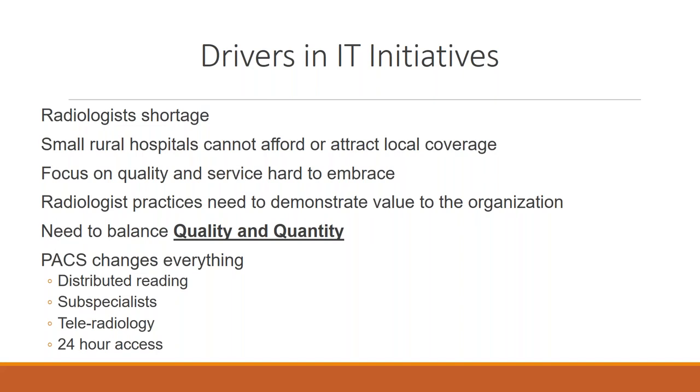The change that came back, the radiologists were good, and we're back into that shortage area again, where they're not as plentiful to be hired. What PACS did is it took small rural hospitals who could not afford to attract local coverage and changed their whole world. Think about some of these small hospitals, some of you on the call might be part of them, where you may have one radiologist and it might even be a struggle to have enough volume to sustain one, let alone two or three.